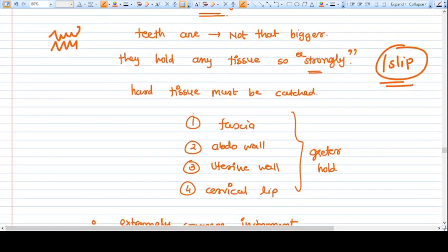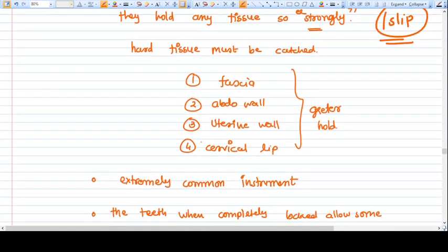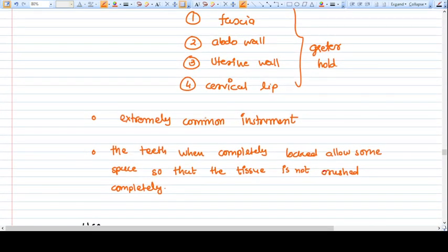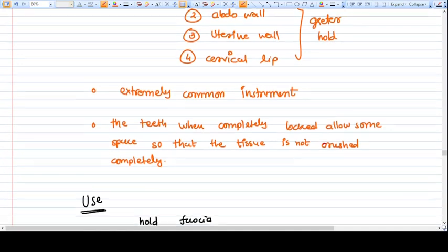Any tissue can be held or caught with the Alice forceps, like fascia, abdominal wall, uterine wall, cervical lip, etc. But remember, the structure you hold must be stronger. You can't hold softer structures with Alice forceps because it will rupture. It's an extremely common instrument.